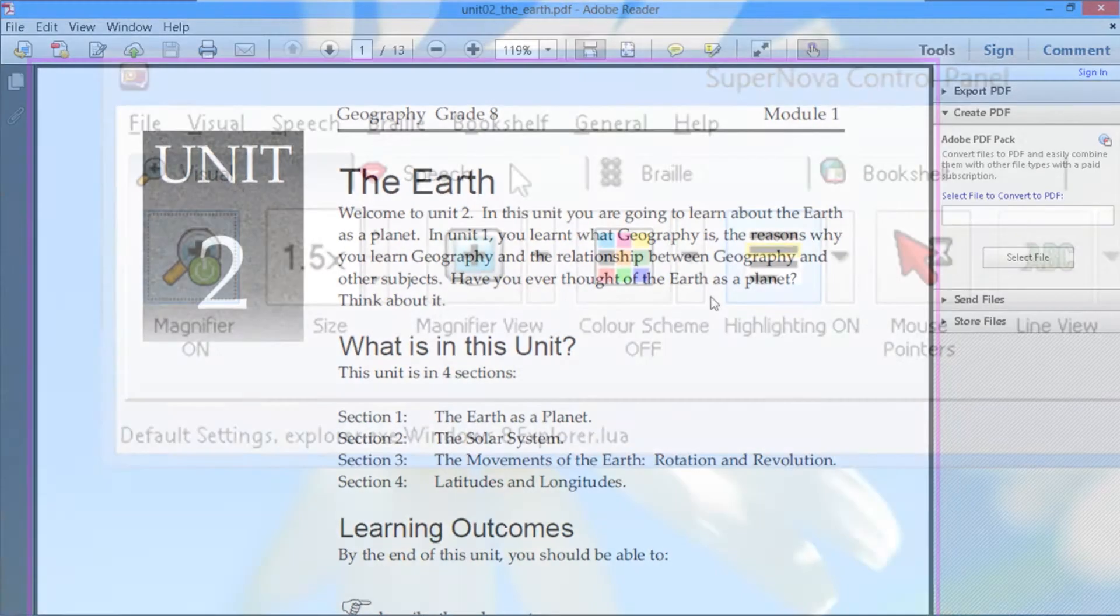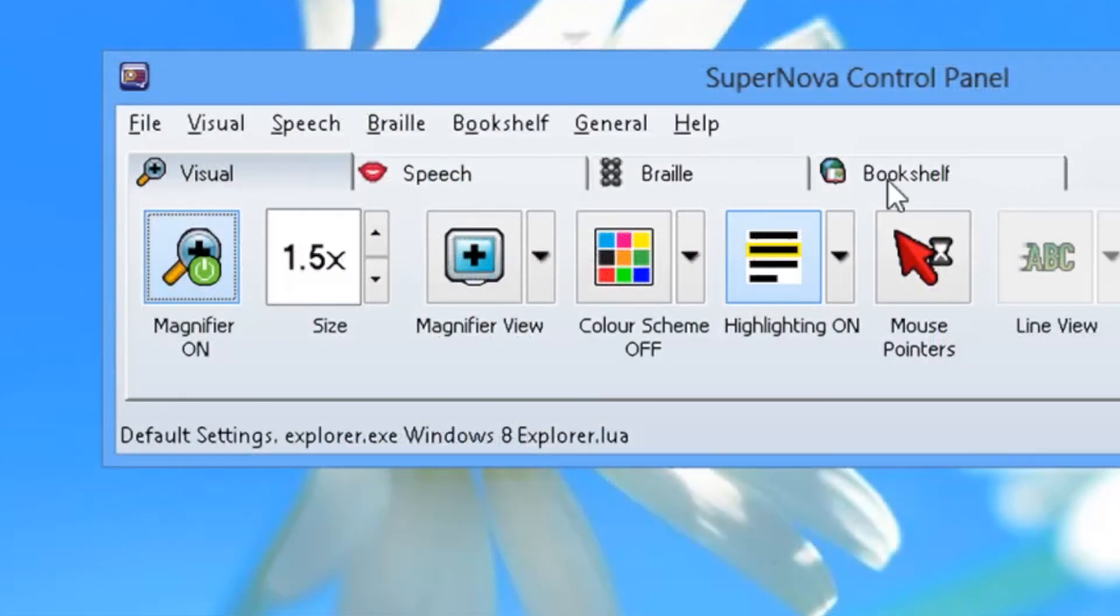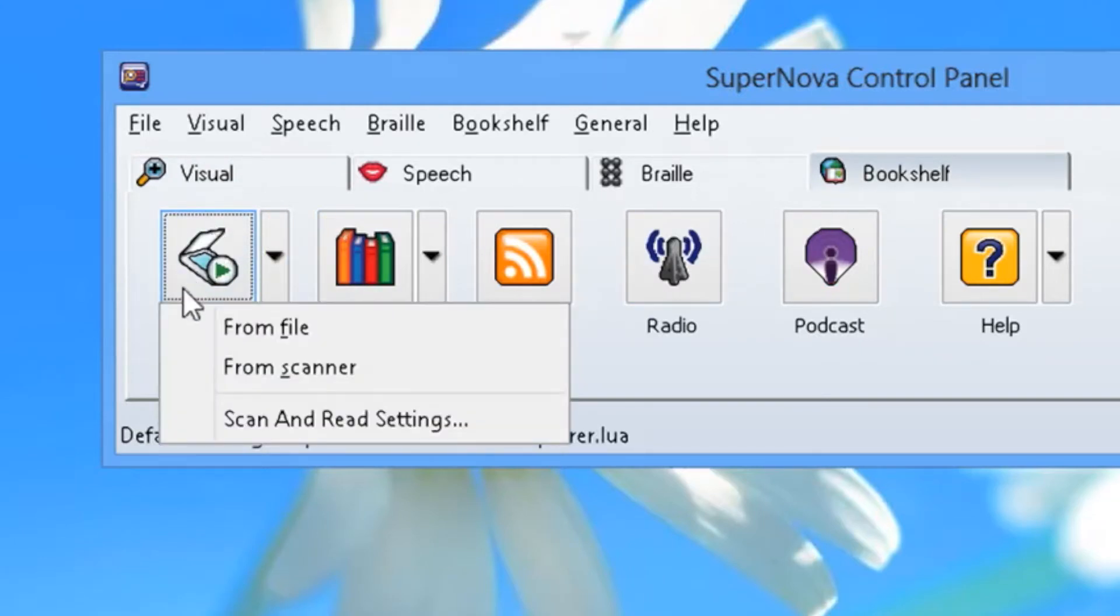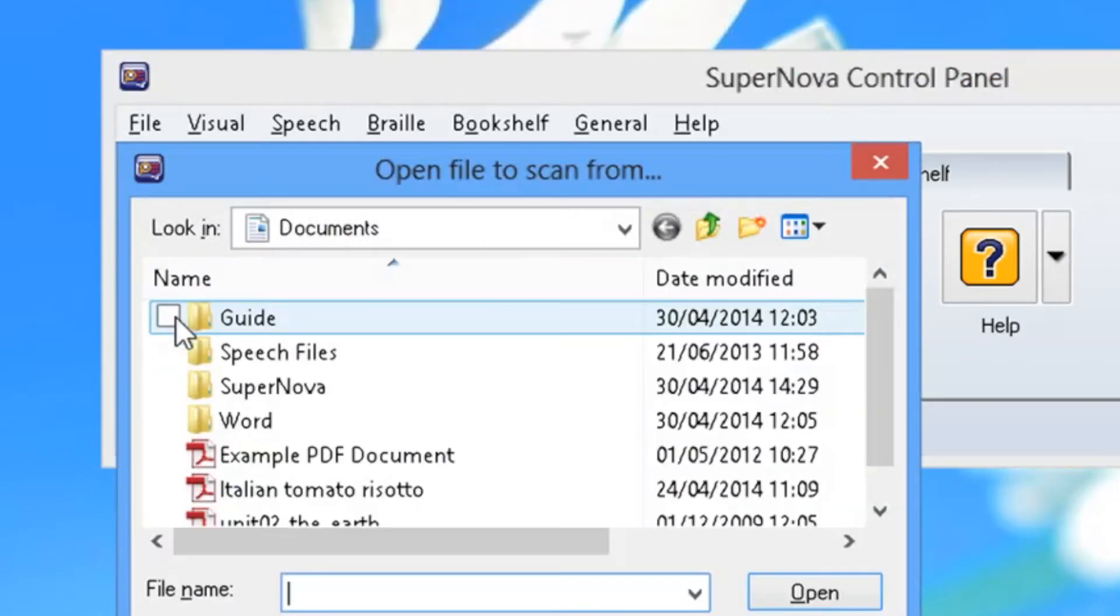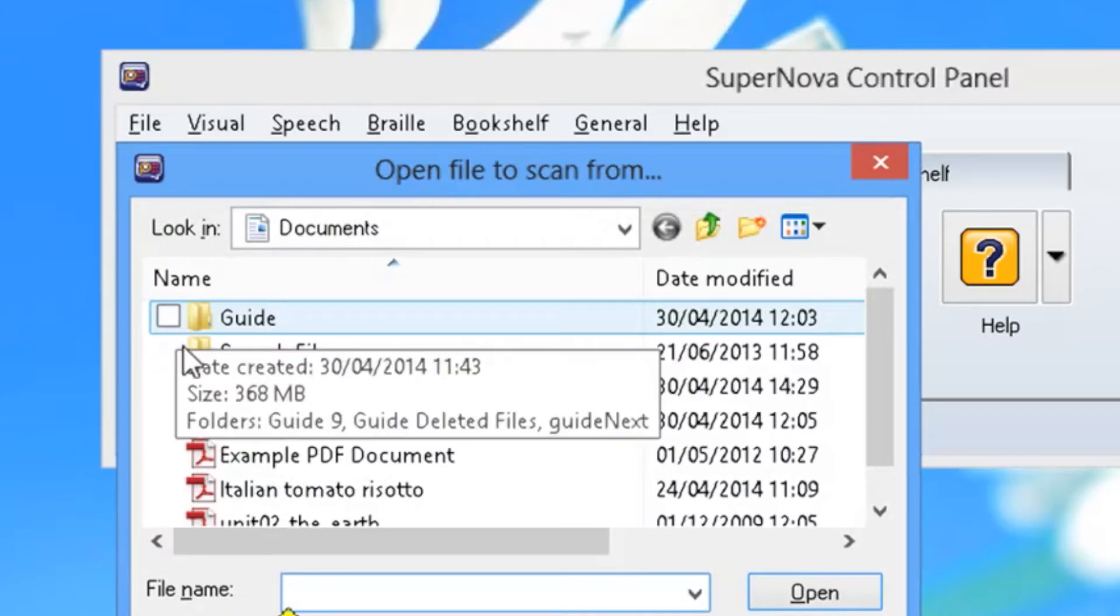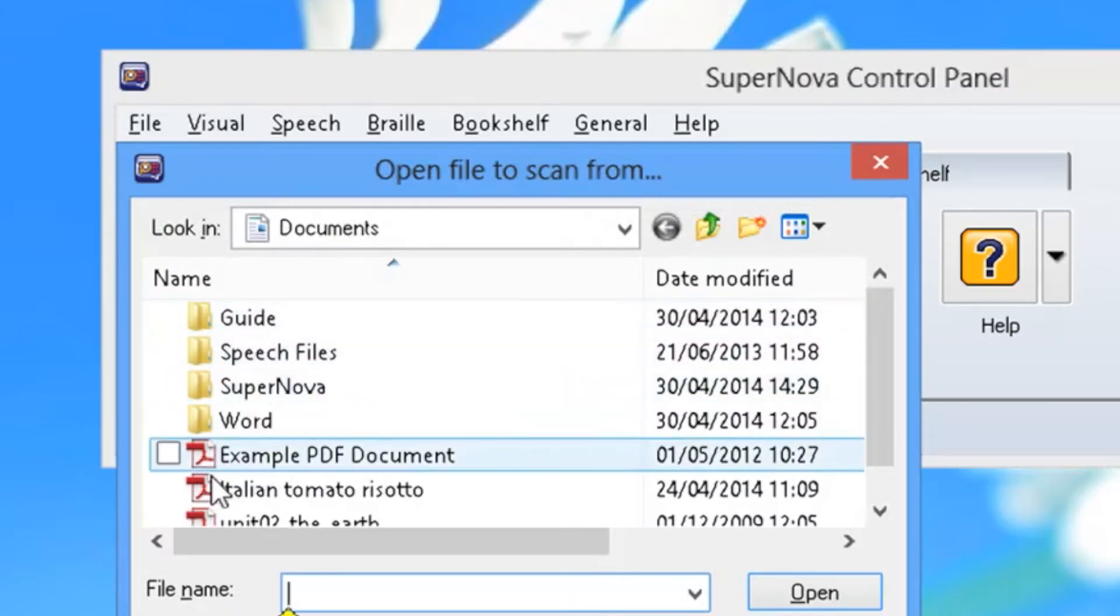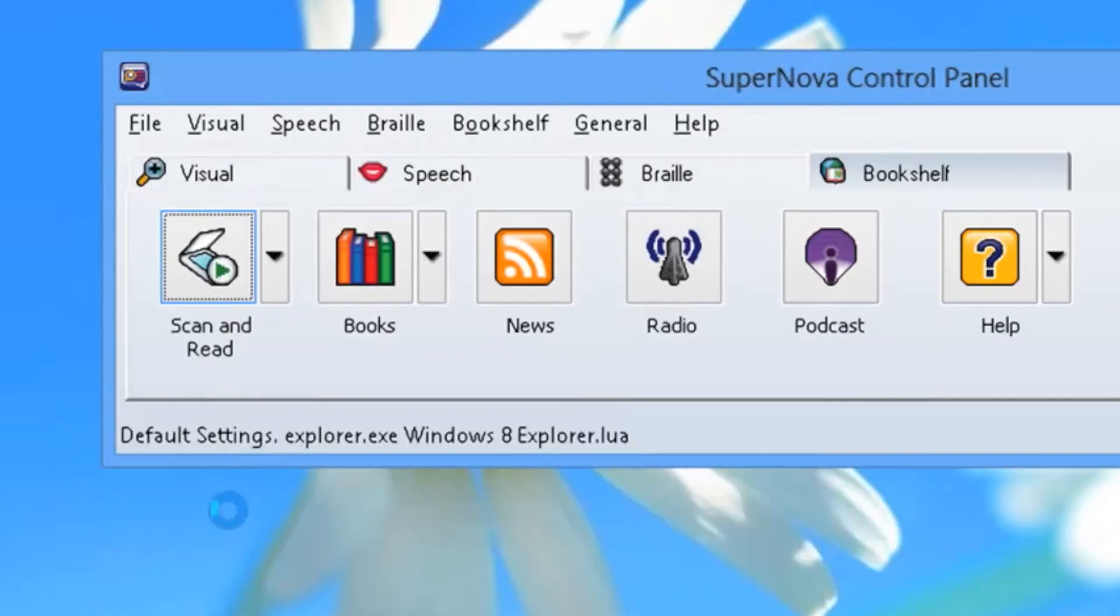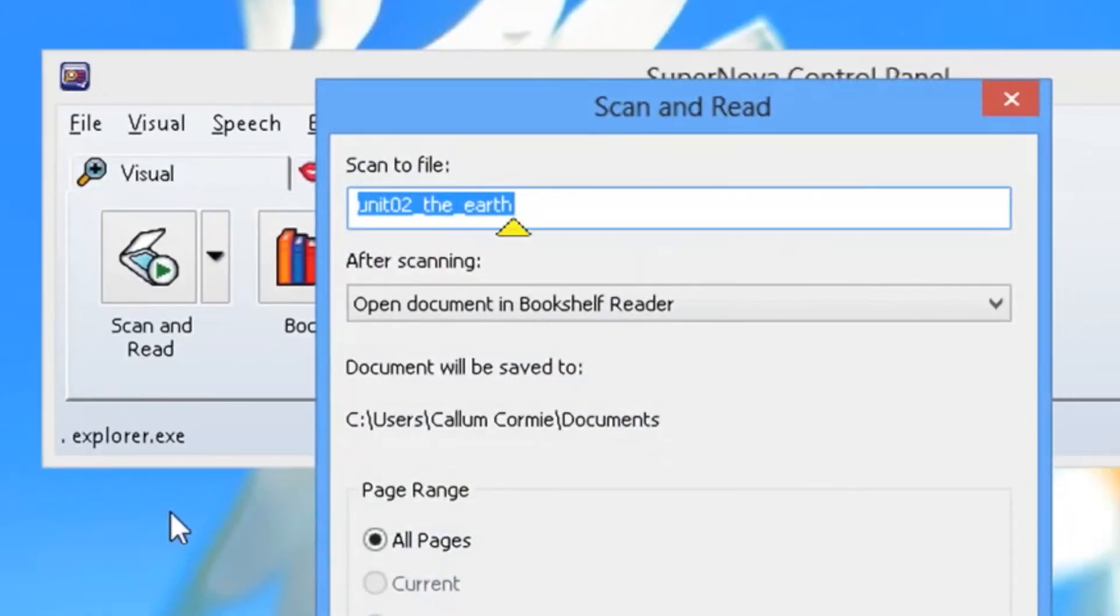If you know a particular PDF needs scanning, in the scan and read menu, choose from file. When you select a file from your documents, the scan and read dialog will appear.